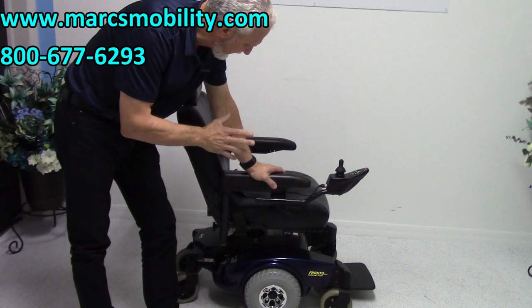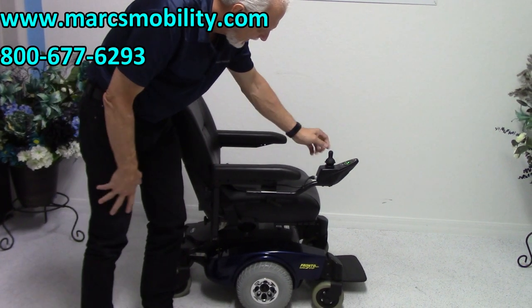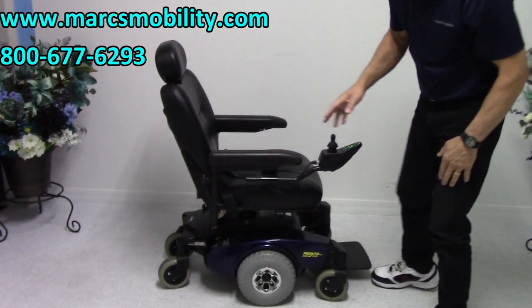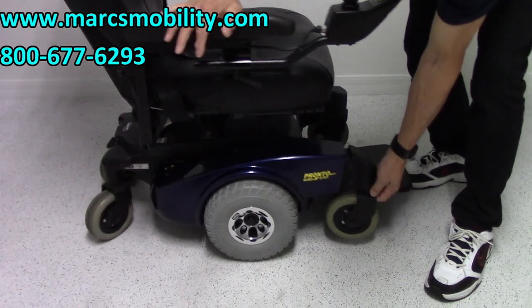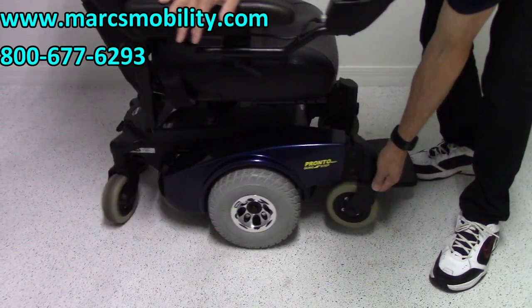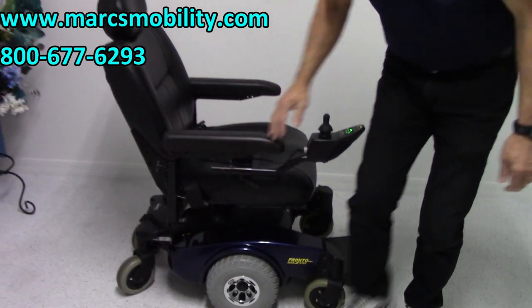This is a Pronto M51. It was used for a few months. Tires are still in new condition — it's six wheels, great suspension. This is one of the few chairs where you can see the front wheel raise straight up in the air. I'm about three inches off the ground right now; you can see the suspension at work right there. Very nice suspension.